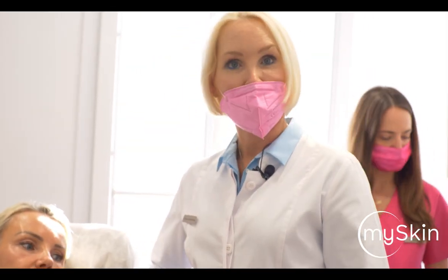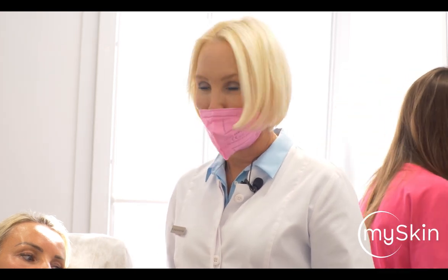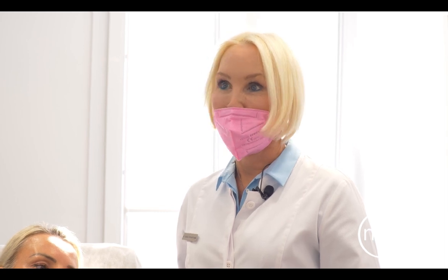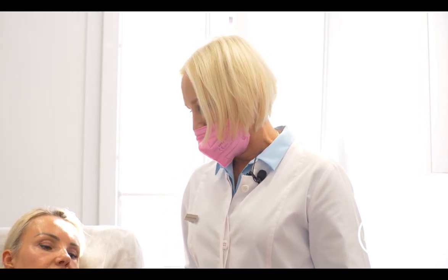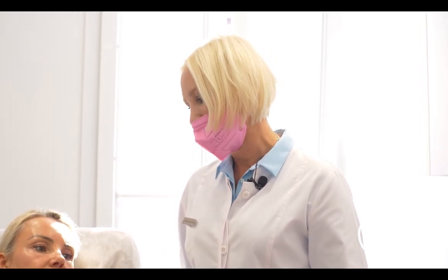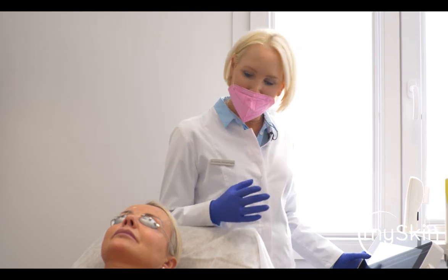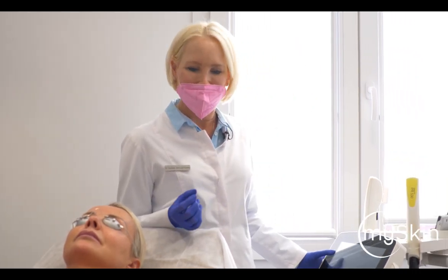My approach for today will be to use the SBT IPL technology with the VL555 handpiece, because the skin on the chest is quite delicate, so we need to be careful with our settings. We don't work as aggressively as we do on the face because the skin has special requirements. Our patient is about Fitzpatrick skin type 2 and her skin is slightly tan, but it's not a fresh tan — it's a tan from the summer.